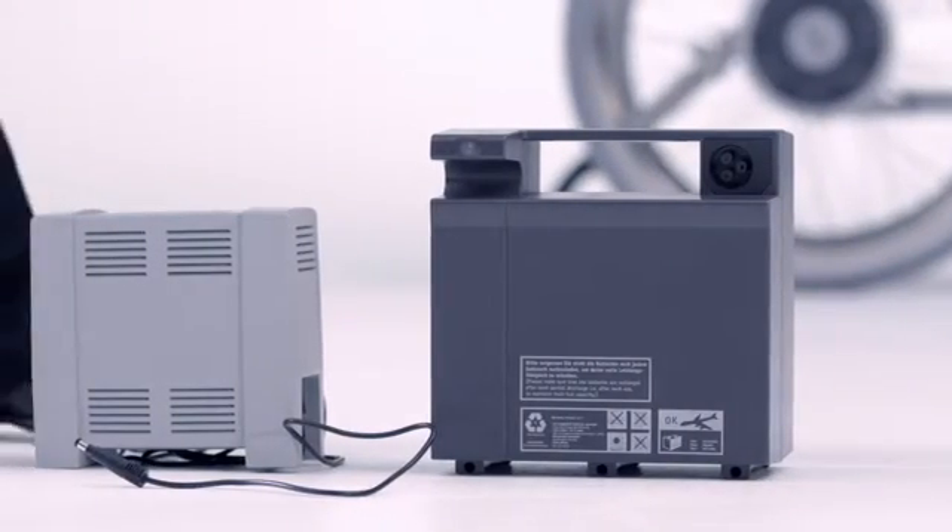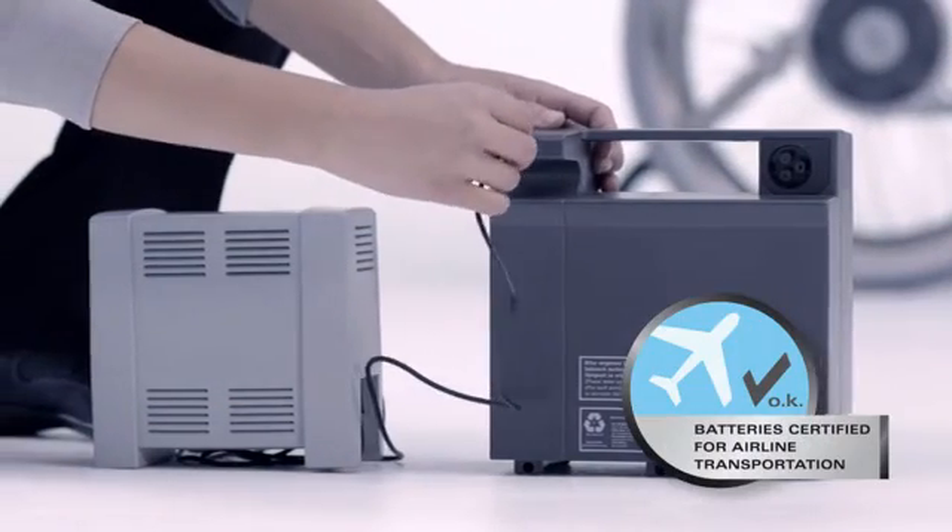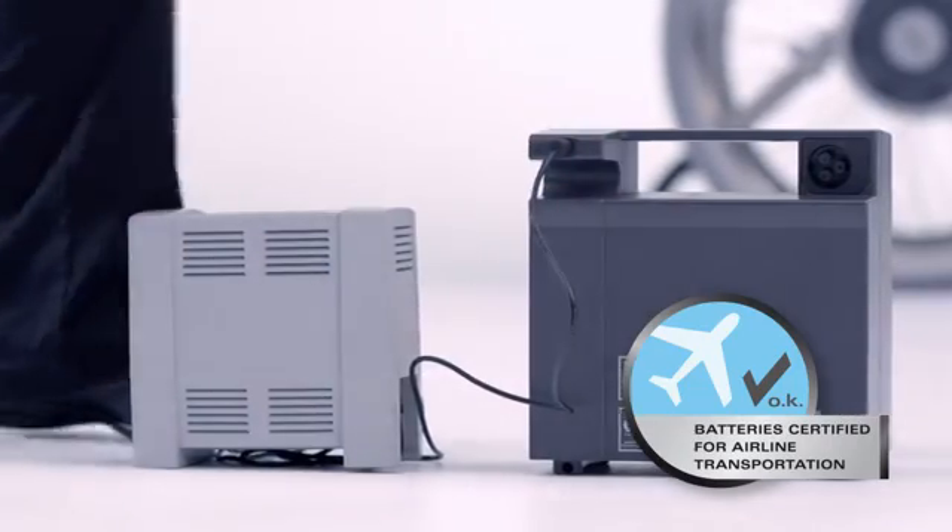The battery packs can be easily recharged using the battery charger. The battery pack is also approved for air travel.